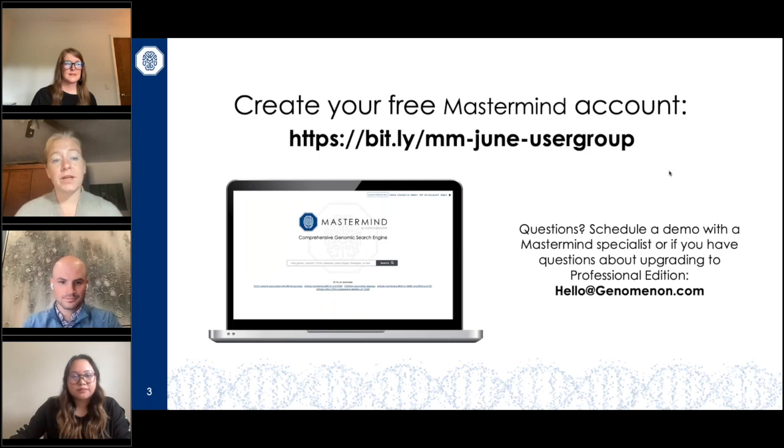So if you're seeing curated data where there is a provisional call in the system and it comes up in that top header toolbar, those are people. Those are trained professionals. We have an amazing curation team who does this at a rate that I have never seen. Their speed is incredible. If you have any questions about those or want to give us feedback, there's a way to do that. But if it's just the system return, where you're seeing sentence fragments, that is the AI, the genomics language processing.